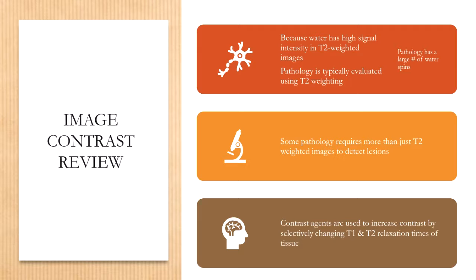We know that in T2 weighted images, any organs or structures that we're imaging will have a higher signal if they contain water, because water is reacting to its T2 decay time and its relaxation times. And so typically on T2 weighted images, we're able to view pathology better.